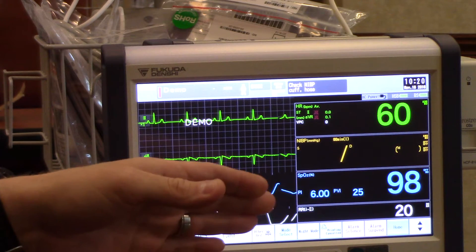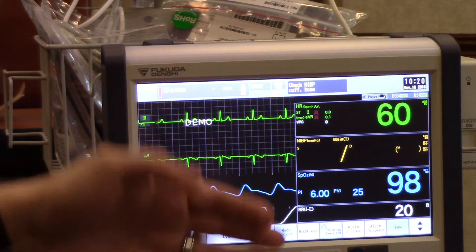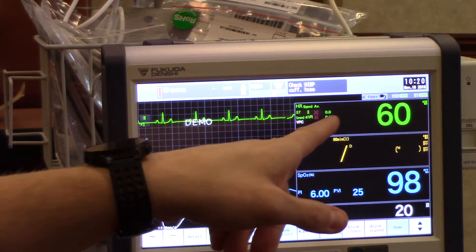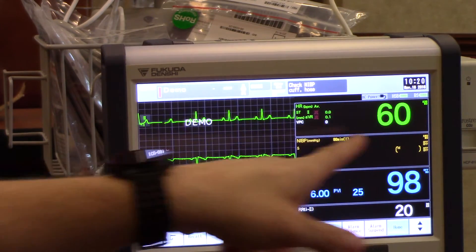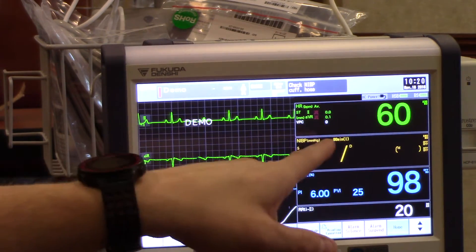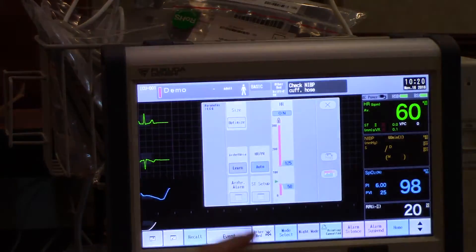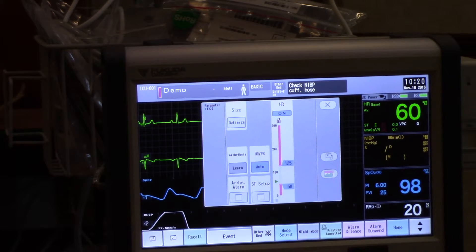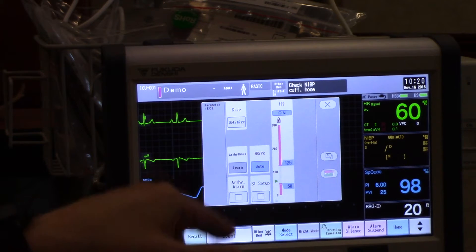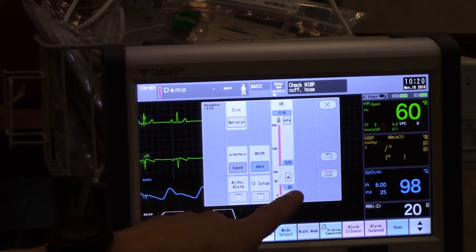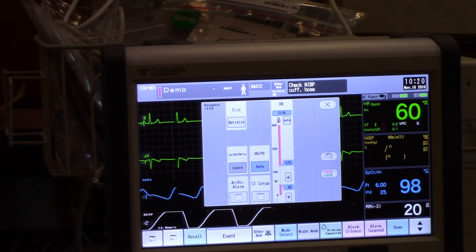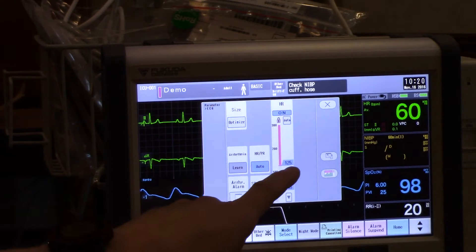If I have a patient that requires me to change the heart rate alarm parameters, all I'd need to do is press inside the numeric area for heart rate. That takes me to my first of two screens. The first screen for heart rate allows me to then select my low or high that I would like to adjust.